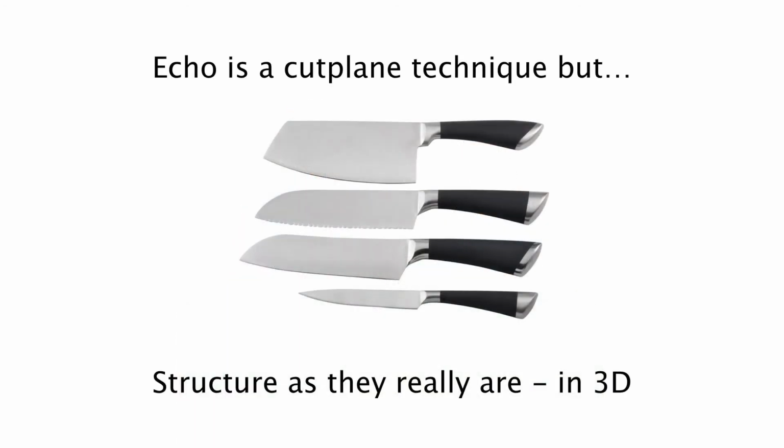Thomas, we've seen really nice examples of views and aortic valves, but is it always so easy to get these views? Well, honestly, not always, because after all, it's a cut plane technique, and we have to sweep back and forth to find the area where you find the leaflets opening or not opening and where the calcification is. But Anna, I think you have something to show us, which is very spectacular.